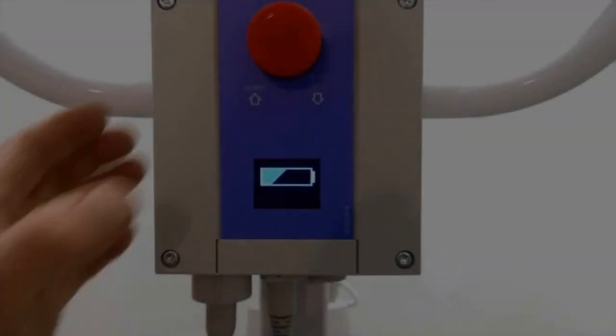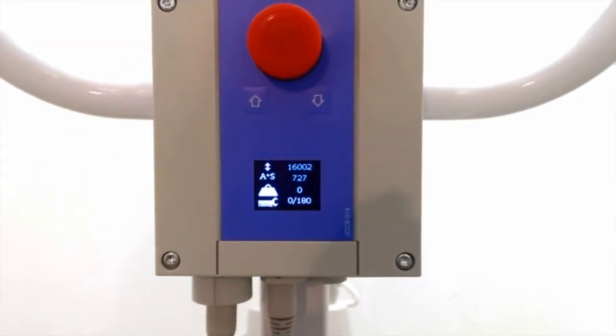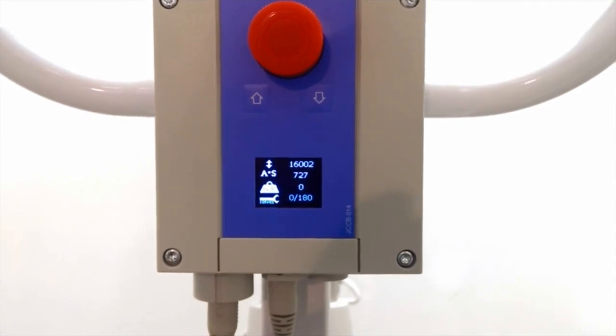To confirm both data points have been successfully reset, check the main data screen via a quick press of the redundant raise button.